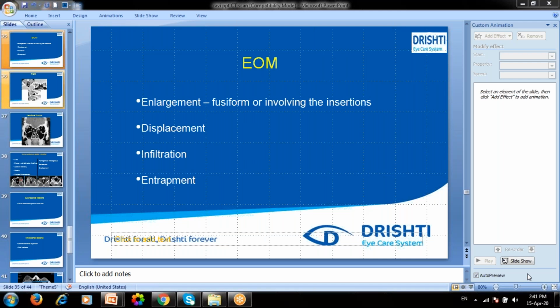If it is a proptosis case, generally you want the posterior surface to be highlighted, right? If it is anterior, if you see an eyelid tumor, then the anteroposterior parts have to be highlighted. If it is a fracture case, the bony area has to be highlighted. So if you write the proper area which has to be highlighted, it will not make so much difference across the generations of CT scan.